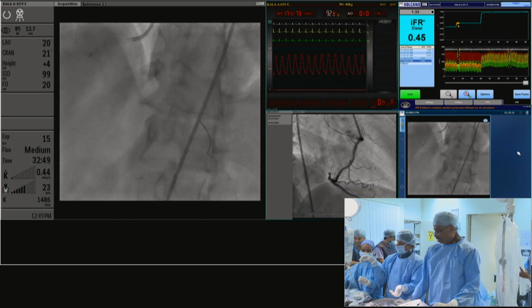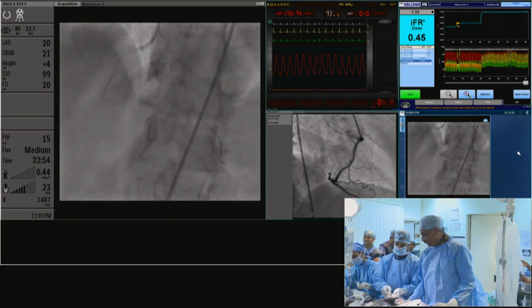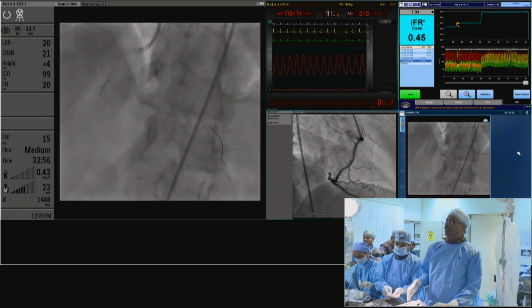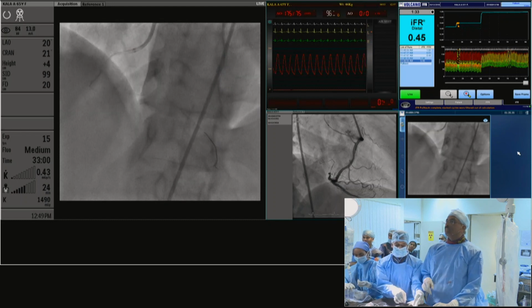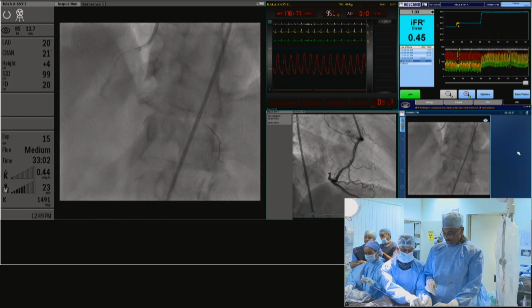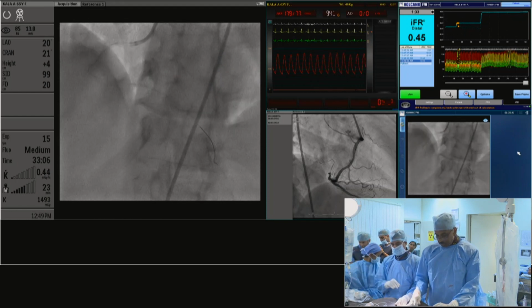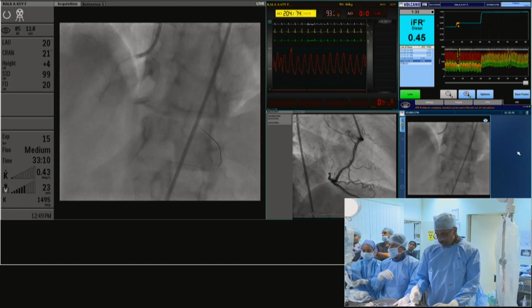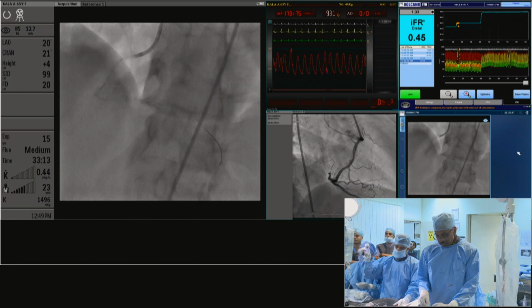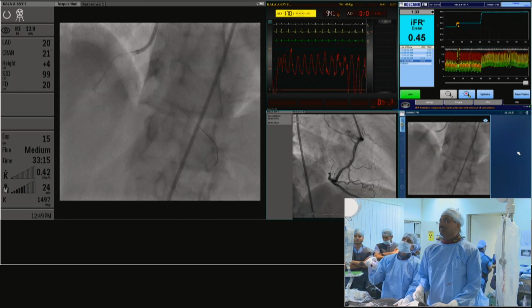Now, if we didn't have IFR, I would have thought that you tackle one of them, take the proximal one. In a calcified lesion, always the proximal one first so that you can reach the distal one. If the IVUS couldn't track, probably use a rotablator. So tell me, how do you put this into perspective? Because now the fellows think that the IFR showed that the proximal mid-segment was not significant, and you ended up putting a 38 millimeter stent.